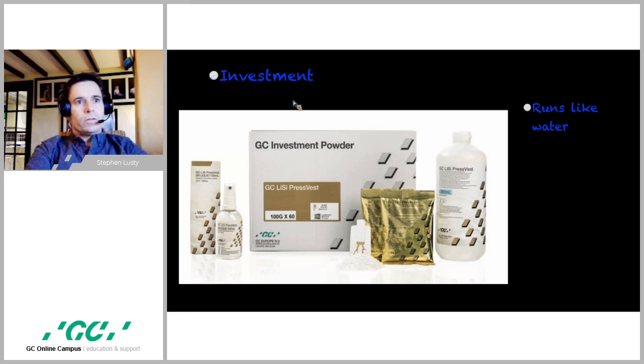And some people are using this investment without the SR spray, and of course that is absolutely fine. But in my opinion, the SR spray is worth using. Because it really has, in my opinion, increased my chances of getting zero reaction layer at all.